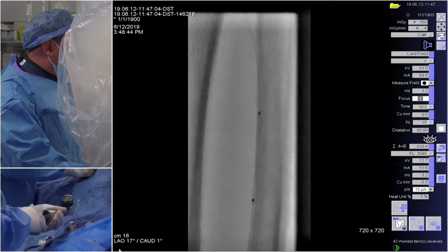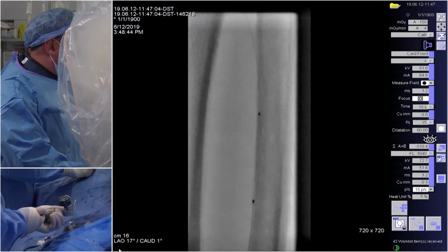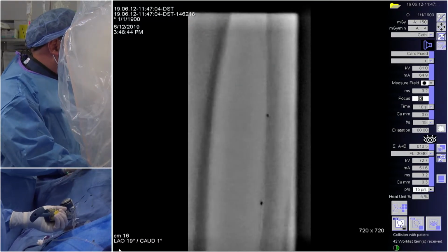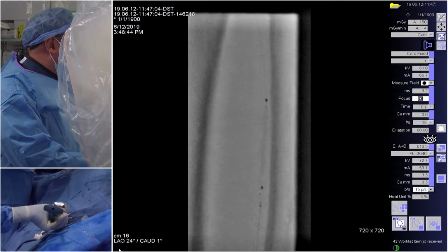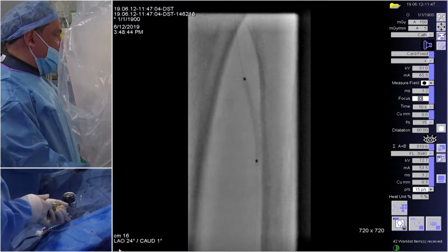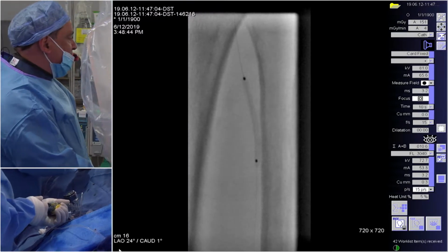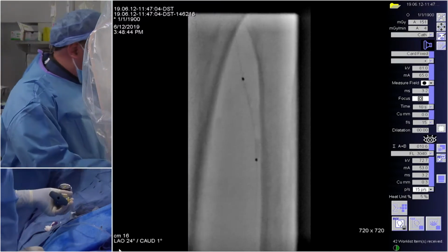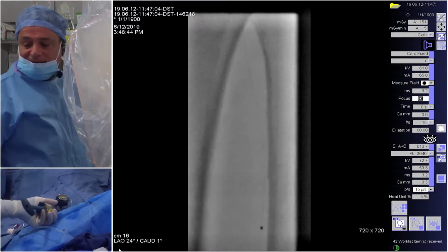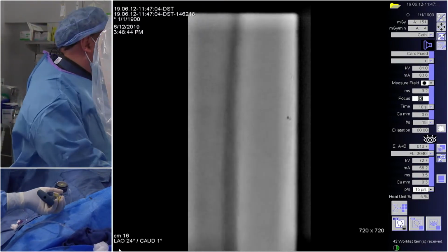I start with this just to get a bigger track up top, and then next I will go with the Boston balloon, which is a little bit smaller, the 0.9 or the 1.0. Sorry, it's from Asahi, I think. Who makes it? Orbus Neich. It's the Sapphire Pro 2.